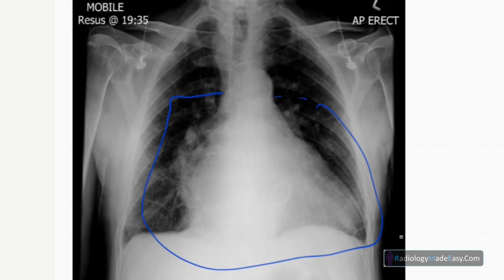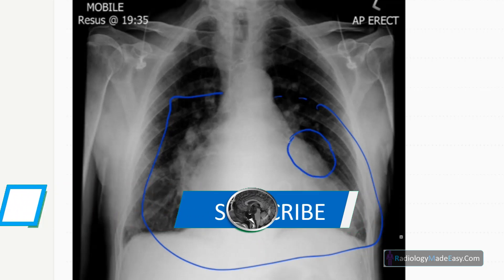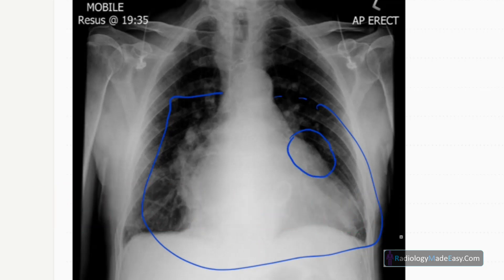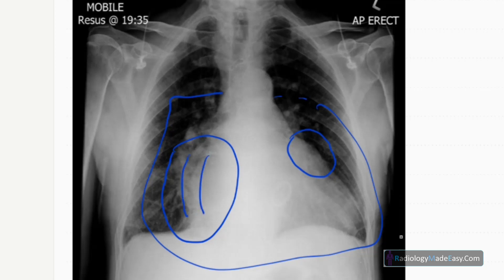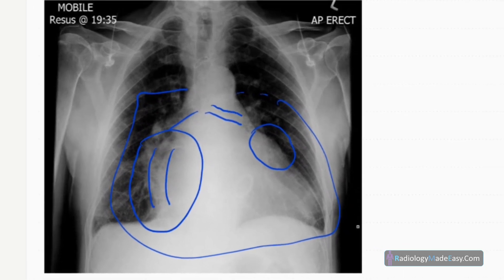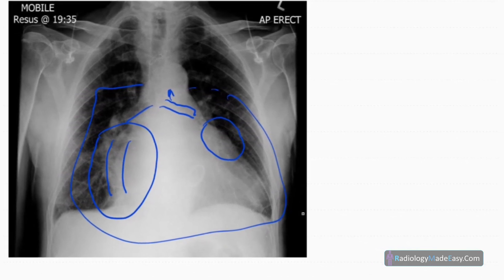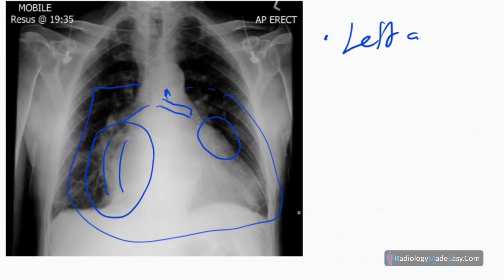You can also see a bulging of the left heart border, which indicates enlargement of the left atrial appendage. On the right side, there are two right heart borders — a double right heart border — seen here and here. Also, the carinal angle is widened, splaying of the carina is seen, and upward displacement of the left bronchus is seen. All of these indicate left atrial enlargement.